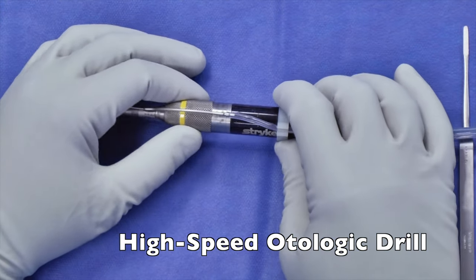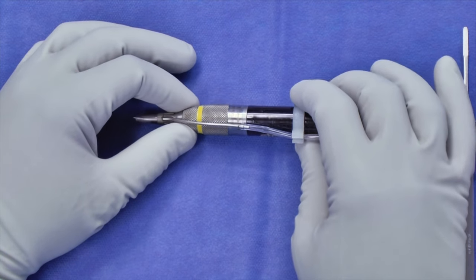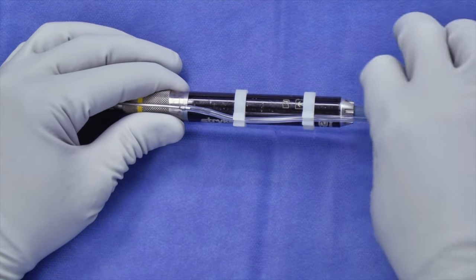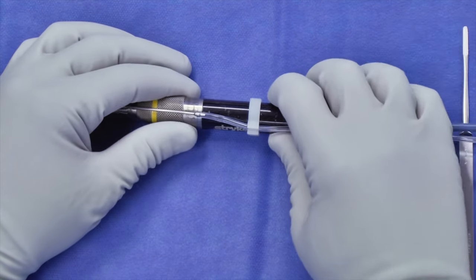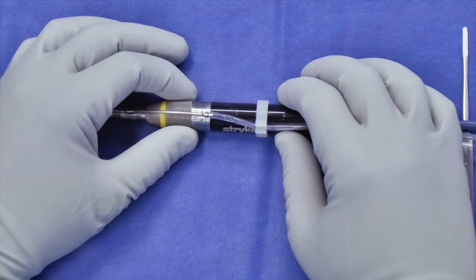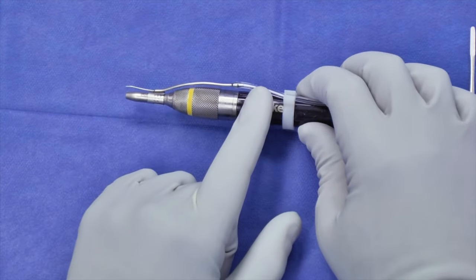Here we have a standard otologic drill. These drills come in many different varieties. The older drills are pneumatic and tended to have a much larger leash that would get in the way — this is an electric drill. Typically when you're drilling in ear surgery, you're going to be using around 60,000 to 80,000 RPMs. This drill has on-drill irrigation, which is our preference here, but many centers will use a suction irrigator where the suction actually has irrigation on the tip as well.